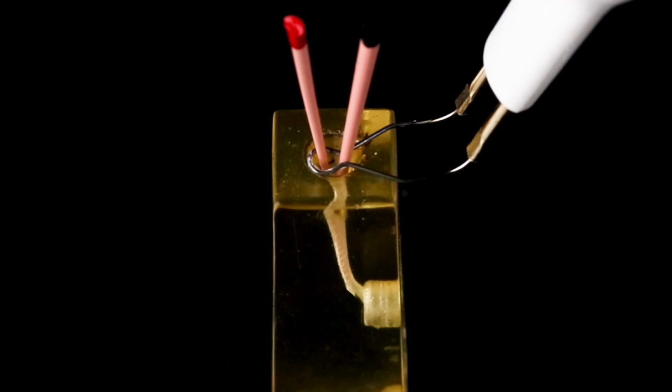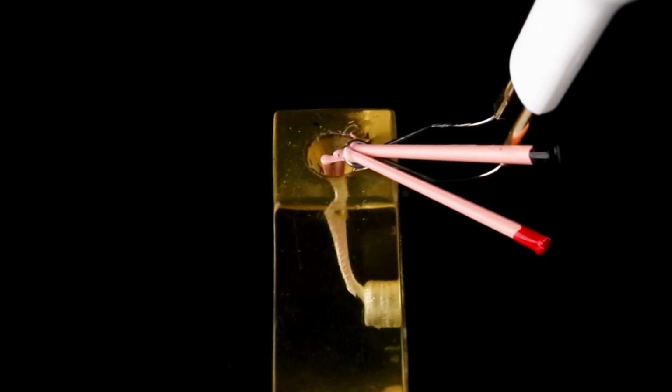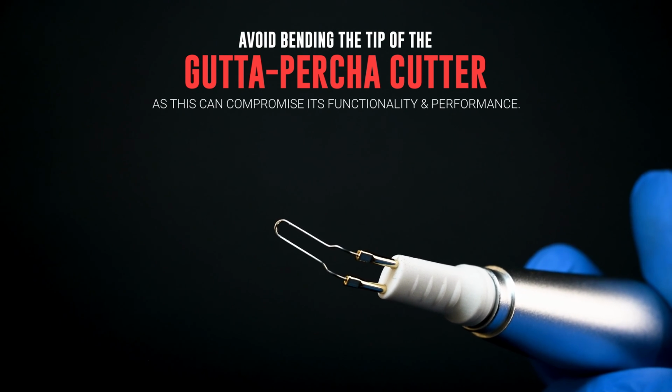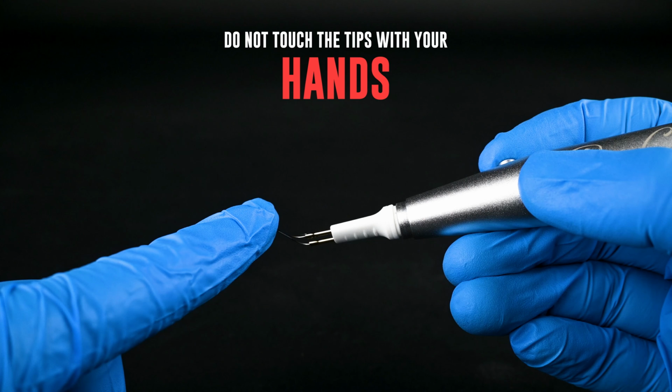Position the SuperEndo ProCut Gutta Percha cutter tip opposite to the operating base for effective and safe cutting. Bending the tip. Avoid bending the tip of the Gutta Percha cutter as this can compromise its functionality and performance. Do not touch the tips with your hands to prevent potential hazards.